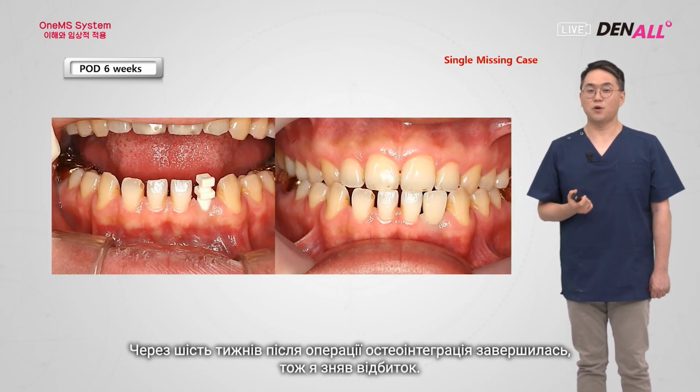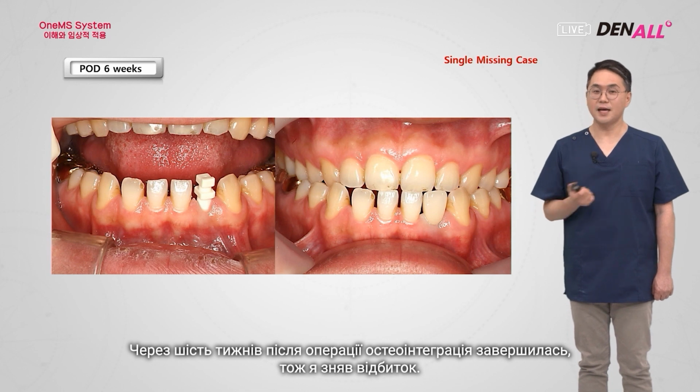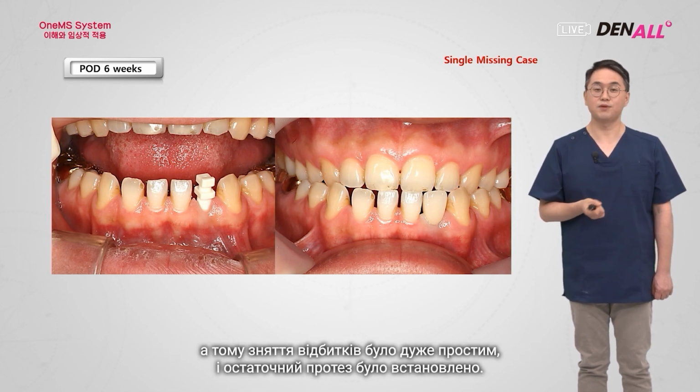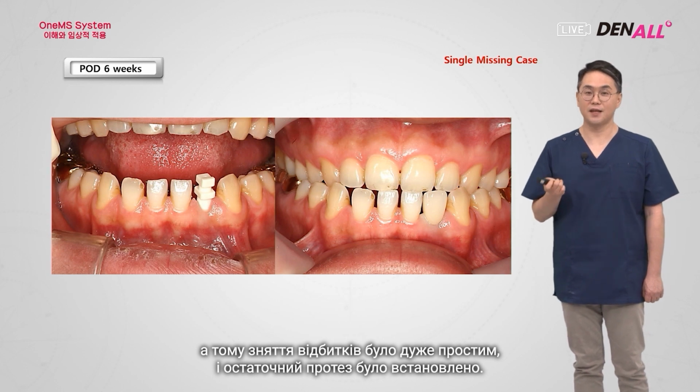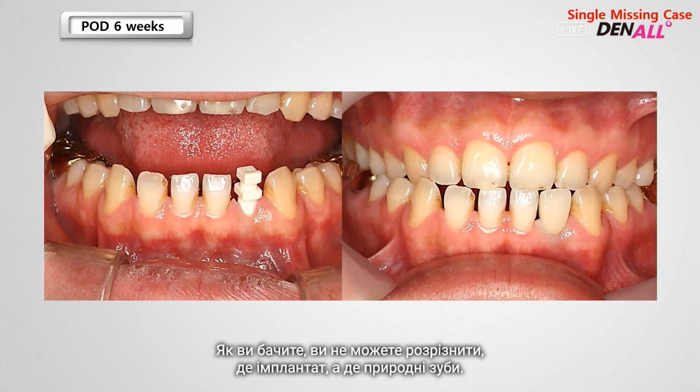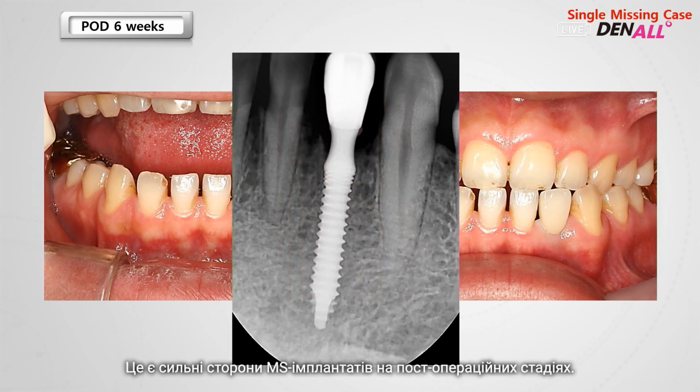After 6 weeks of surgery, osseointegration was complete, so I took an impression. In taking impressions, the plastic impression cap is a clip-on type, so it's very simple impression taking, and the final prostheses were delivered. And as you can see, what is implant versus what is natural teeth, you cannot distinguish. So these are the strengths of the MS implant.